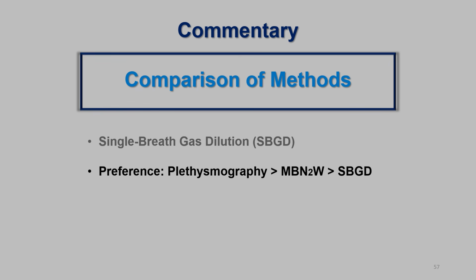With properly performed testing, using well-calibrated instrumentation, the reliability of all the currently performed static lung volume tests actually reflecting static lung volumes is as follows. Radiographic equals plethysmographic, which is better than multiple breath gas dilution, which is better than single breath gas dilution. Comparing TLC values derived from the various methods is a practical method of laboratory quality control.